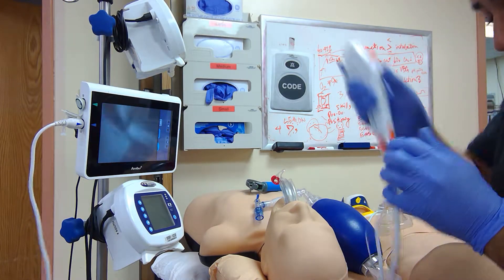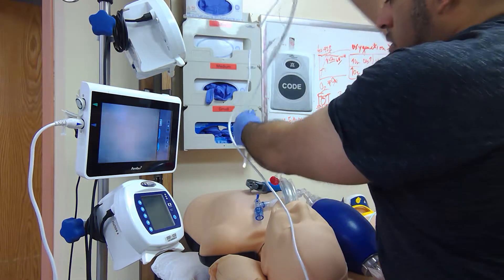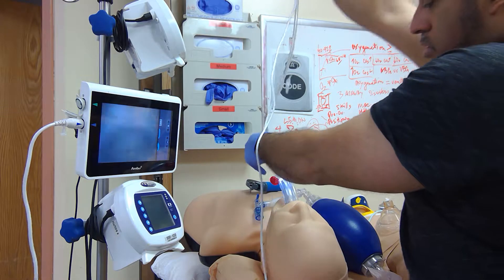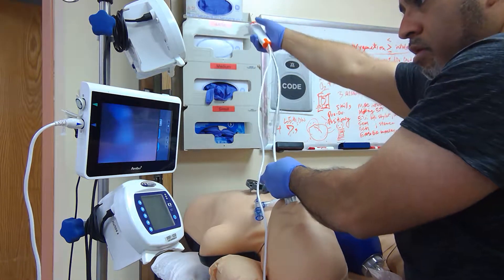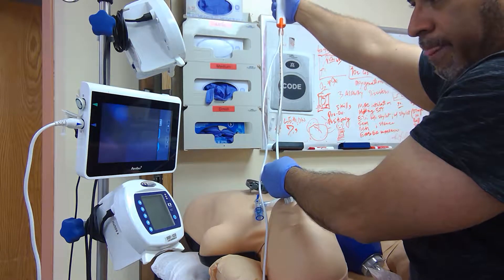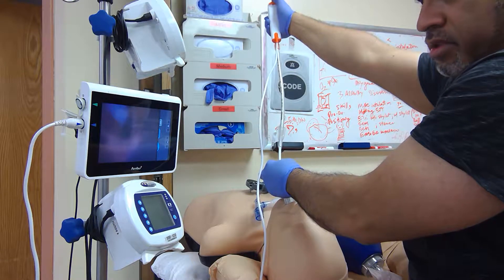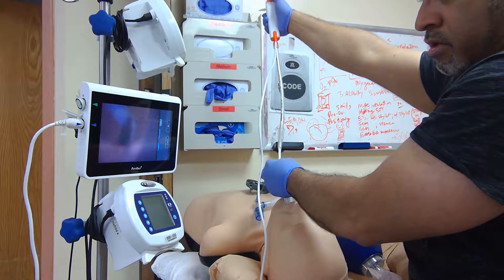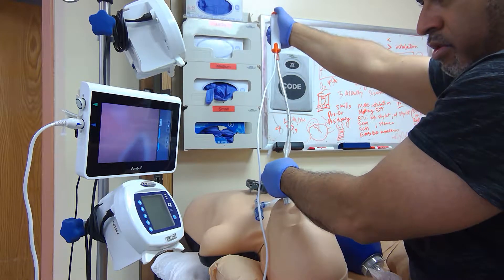Are you ready to scope and intubate? Orientation up and down. So this is showing me the tag to look up. It's longer here. The glottic opening is in view. Getting closer. I'll try to thread it through.